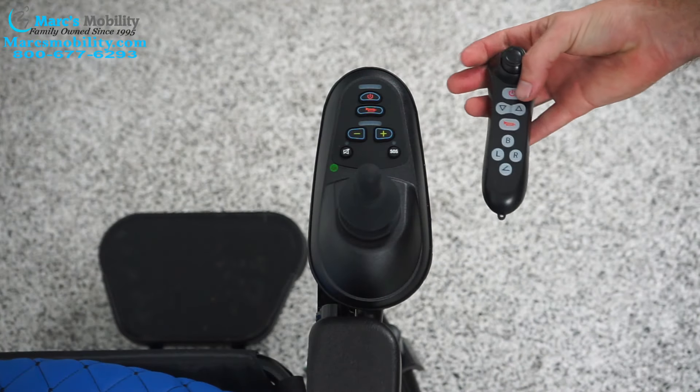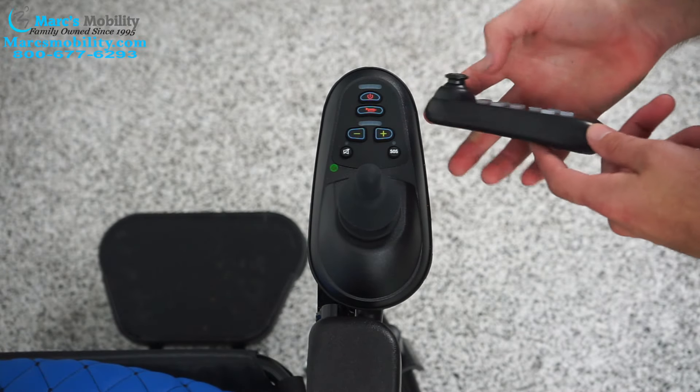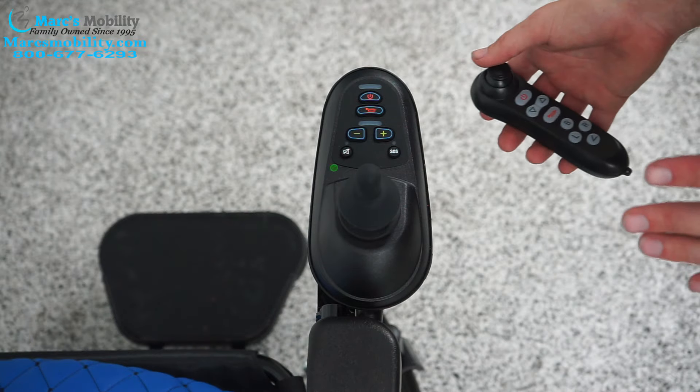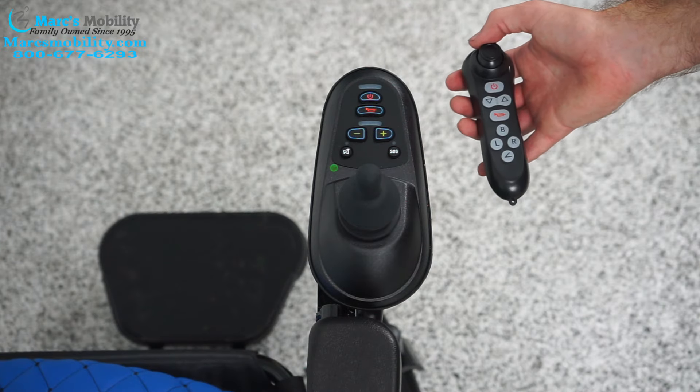When you get your chair in, your remote should come paired already. So all you have to do is put the batteries in and turn on the remote, turn on the joystick — it should work. If for whatever reason it doesn't work, or it gets disconnected, or you have to order a new remote, here's how to sync them up.